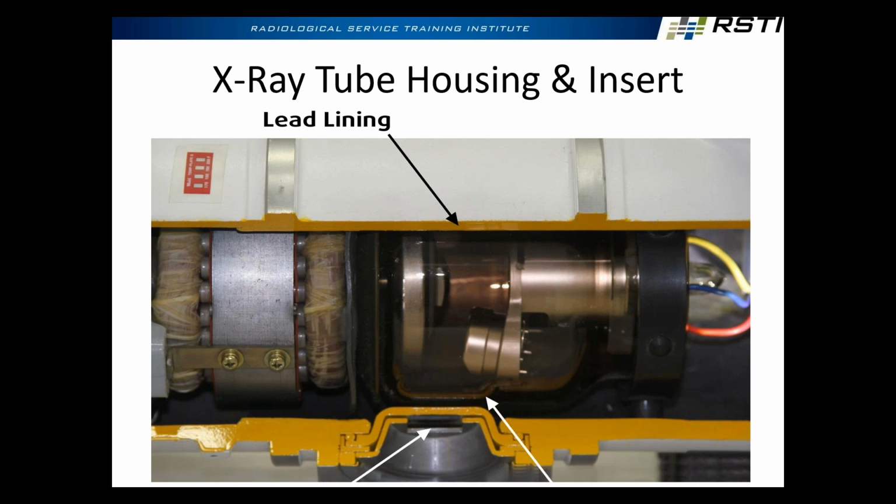When I'm checking things, if I'm checking for an open filament, stuff like that, I need to check the cathode side of the tube, of course. But I want to know which side that is. Usually it's labeled, but not always.